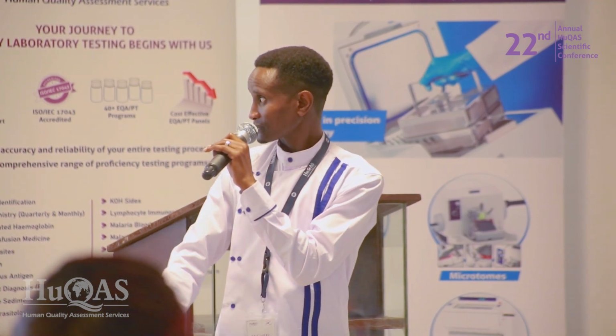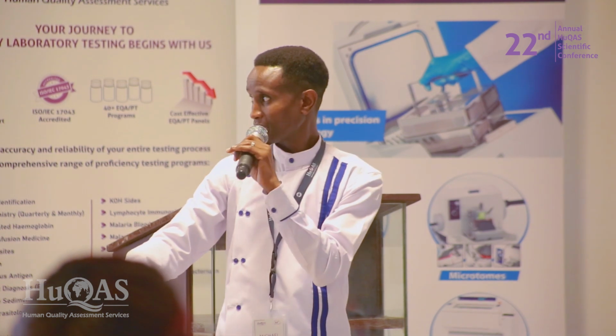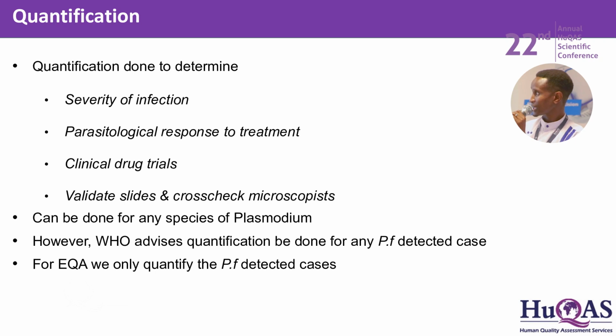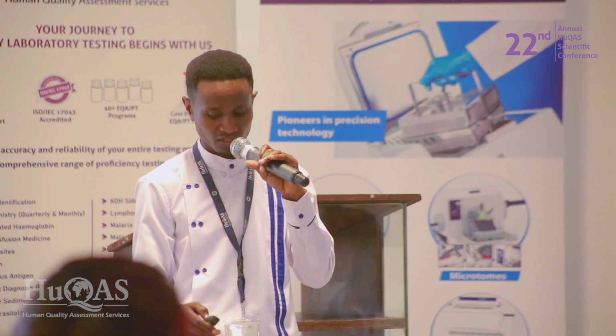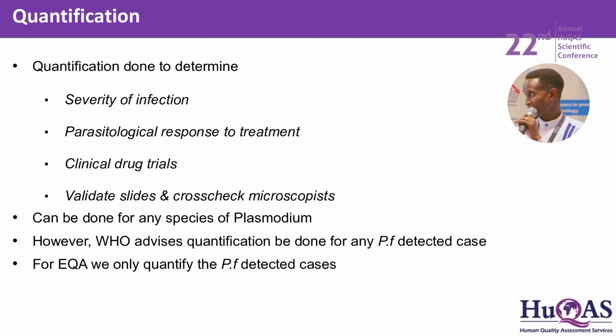So let's go to the next aspect, which is quantification. Quantification is done to determine a few aspects, one of them being severity of the infection, which is very important. When the patient is on treatment and coming back for follow-up, we usually still use microscopy to determine response to treatment. Again, those doing clinical drug trials like Emory require this, and depending on the SOP, maybe they will do quantification for all the species.